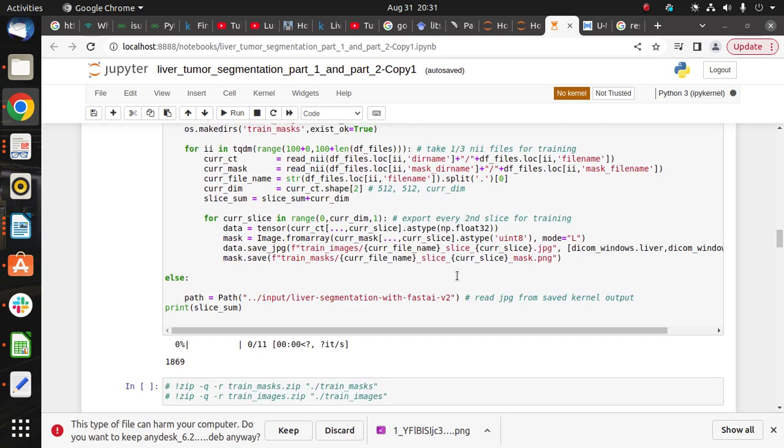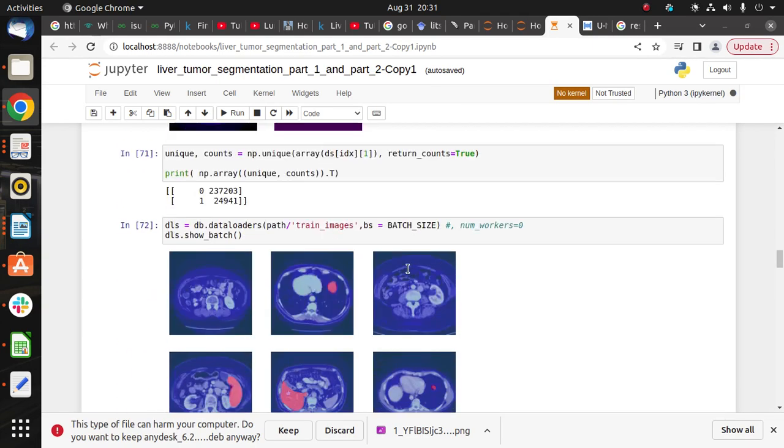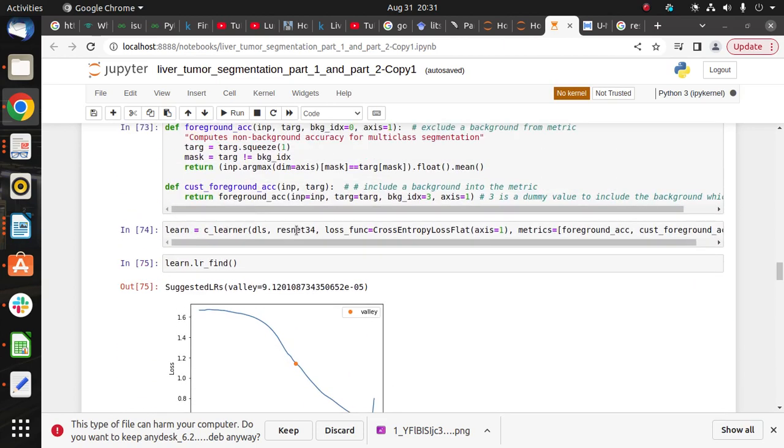For model training we use FastAI. Here we use U-Net and ResNet. The ResNet model for training. U-Net is used for the image segmentation task for biomedical images. U-Net is built as an encoder network followed by a decoder network.